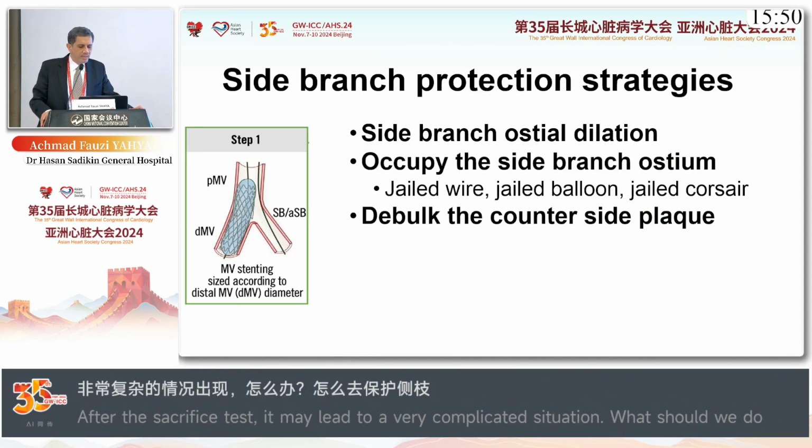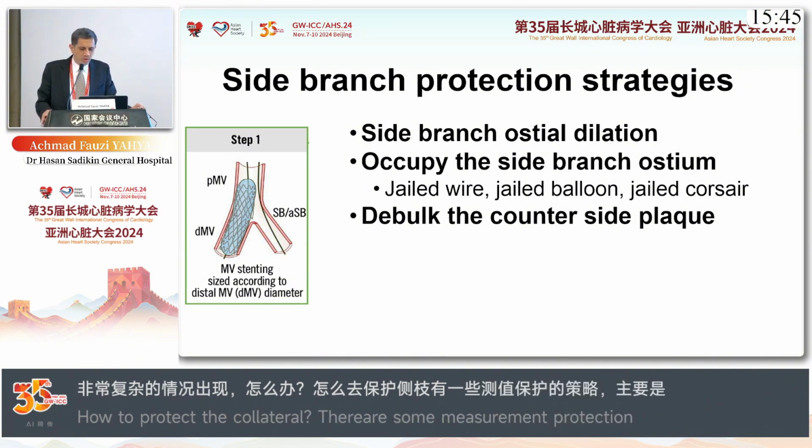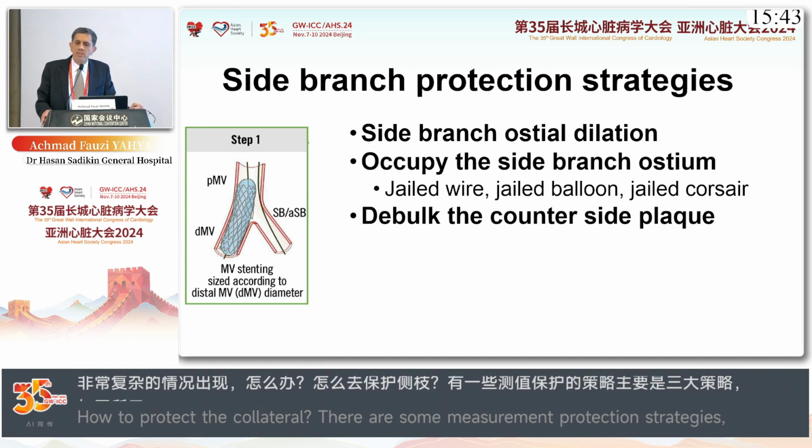There are three strategies to protect the side branch. First, side branch ostial dilatation.